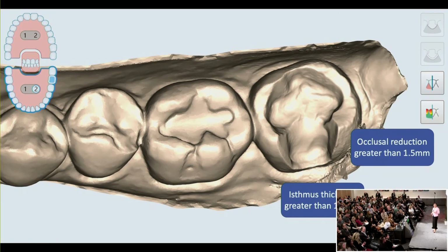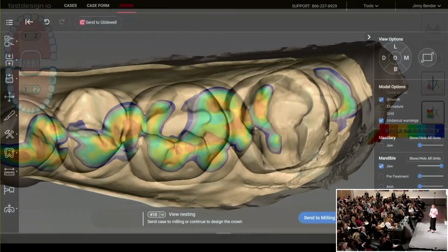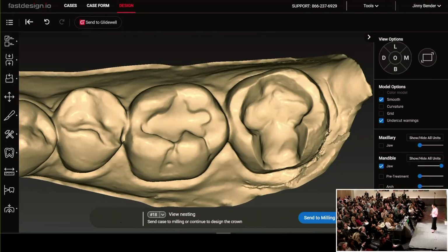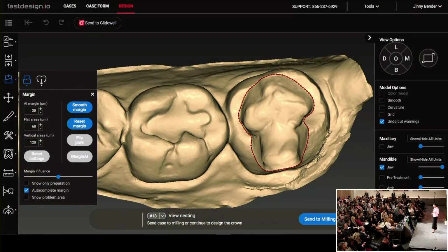So you want to make sure you have good occlusal reduction. And I checked the occlusogram just to check and see where the contact points are with the rest of the tooth. And then it goes to the fast design, and I get my margin. And I have to tell you, the software design engineers have done such a great job. It marks the margin so quickly. Lately, I feel like I have only had to touch it a couple of times in a couple of areas. It's incredible.